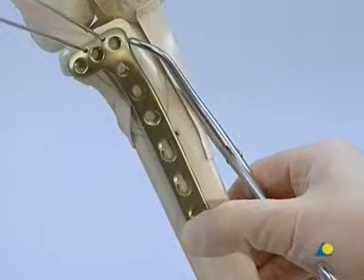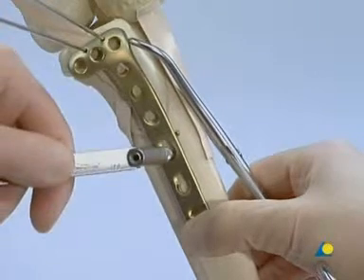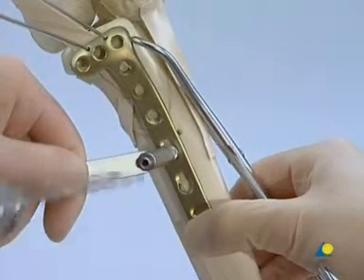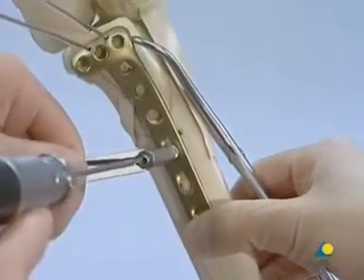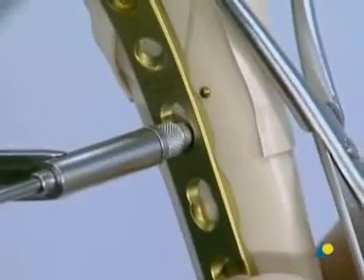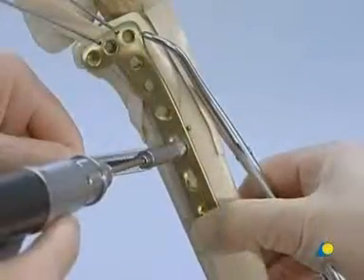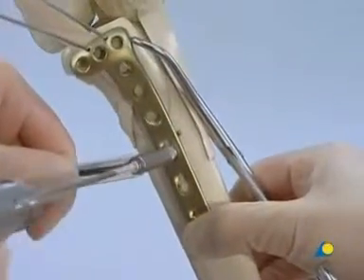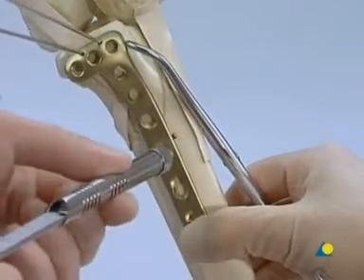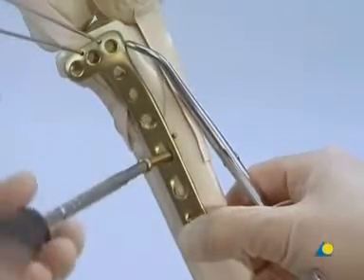The first screw is inserted through the plate hole just distal to the apex of the fracture. The 4.5/3.2 universal drill guide is used in the neutral position. Both cortices are drilled through using the 3.2 mm drill. After measuring and tapping, the 4.5 mm cortex screw is inserted.